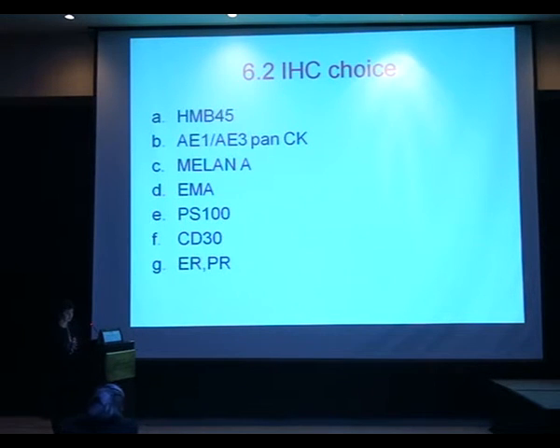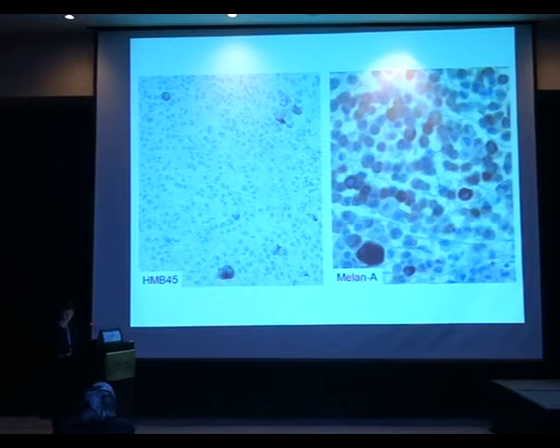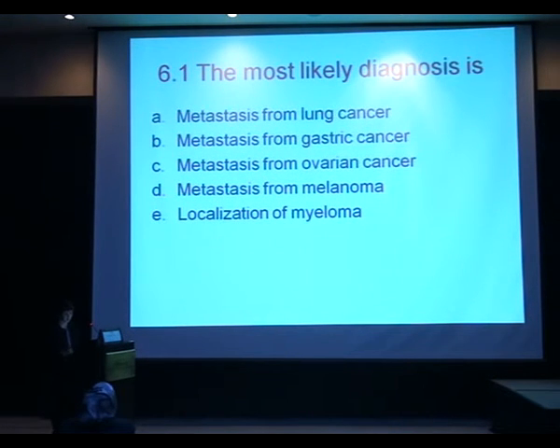So we have different options here, and in fact we performed different immunohistochemistry. We started with the epithelial markers, so with the pancytokeratin and EMA, and of course, as I said, we did ER and PR. So they were negative. The tumor was EMA negative, pancytokeratin negative. So that's why we moved to a possible metastasis in the breast, and in fact the tumor was PS100, melan-A, and HMB45 positive. So it was a metastasis. So here it's a metastasis from a melanoma, of course, with this aspect.